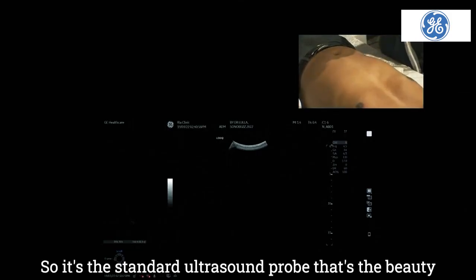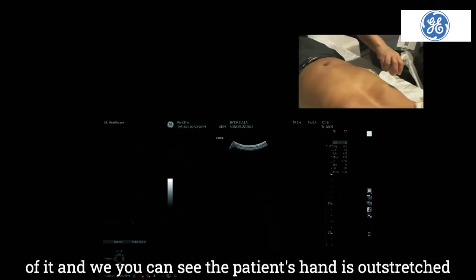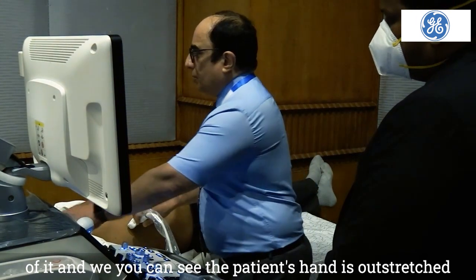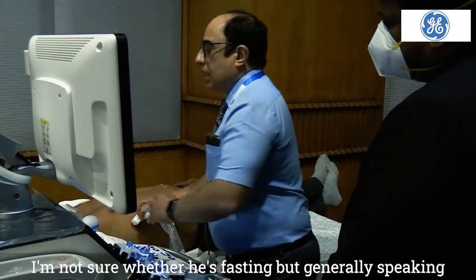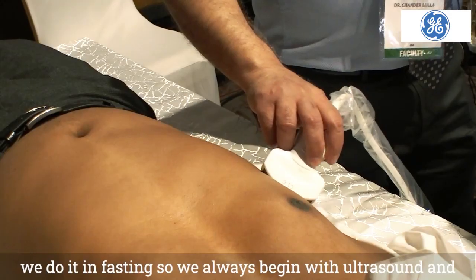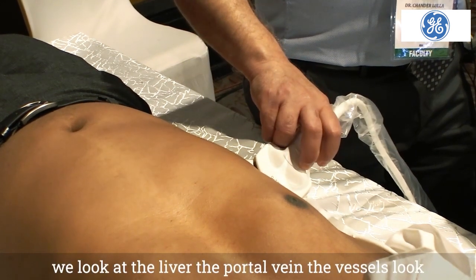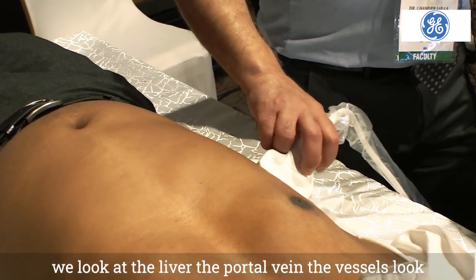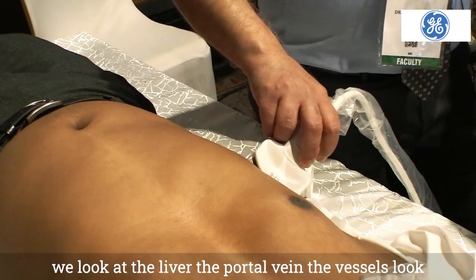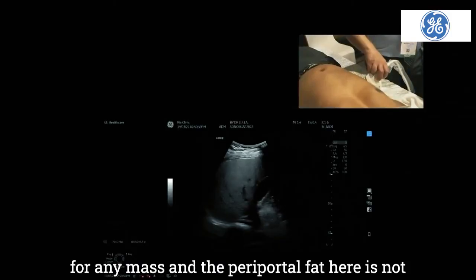So it's the standard ultrasound probe. That's the beauty of it. And you can see the patient's hand is outstretched. I'm not sure whether he's fasting, but generally speaking, we do it in fasting. So we always begin with ultrasound, and we look at the liver, the portal vein, the vessels, look for any mass. And the periportal fat here is not distinct.